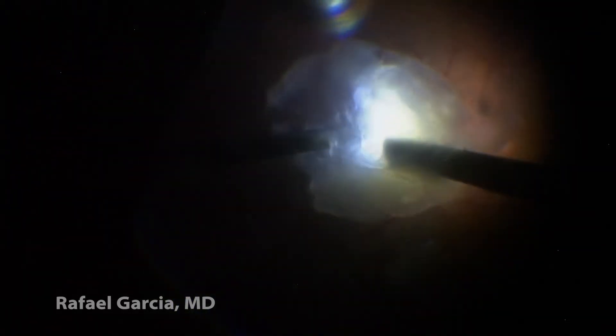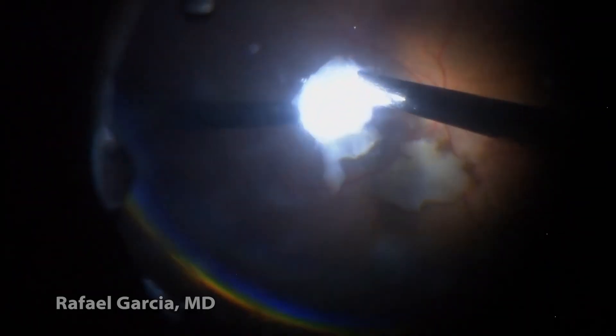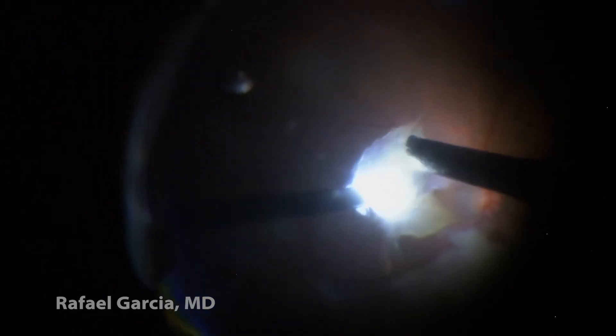Regarding the surgical technique, as we can see here, we should first engage the nucleus with high vacuum, move it away from the retina for safety, and then use the ultrasonic energy to take down these fragments. It's possible to notice how nicely and efficiently these cataract pieces are emulsified — one by one, each piece is caught, pulled up and away from the retina, and then easily aspirated.